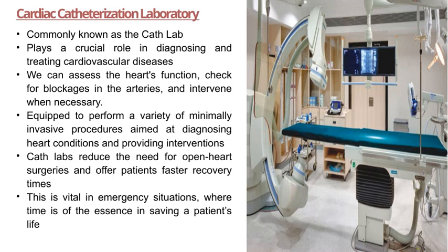Welcome to our overview of the Cardiac Catheterization Laboratory, often called the Cath Lab. This specialized facility plays a vital role in diagnosing and treating heart conditions. It allows us to assess how well the heart is functioning, identify any blockages in the arteries, and perform interventions when needed. The Cath Lab is equipped to carry out a variety of minimally invasive procedures, which means less trauma for patients and quicker recovery times.